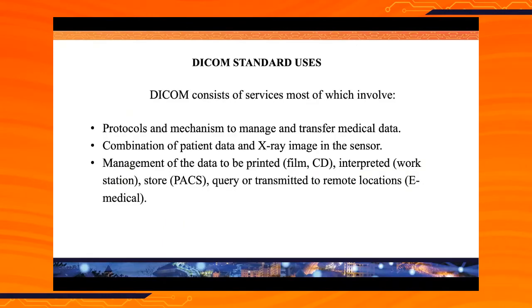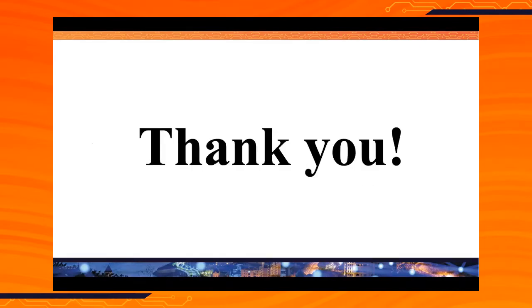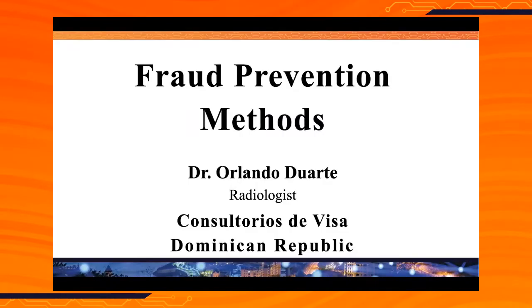DICOM consists of services, most of which involve protocols and mechanisms to manage and transfer medical data. The combination of patient data and X-ray image in the sensor, and the management of the data to be printed, interpreted, stored, queried, or transmitted to remote locations. The last part of the lecture will be about fraud prevention methods.